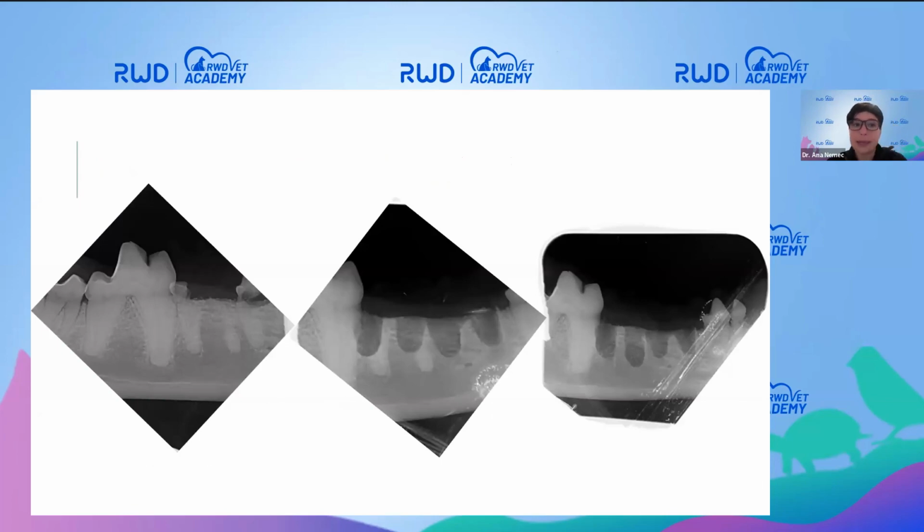This is one of the cases, and probably you've seen that before if you are working quite a bit in veterinary dentistry. You can clearly see that the third and fourth premolars on the mandible are resorbed, and part of the tooth is actually replacement resorption. But then again, we can still see these obvious root tips with pretty clear periodontal ligament, possibly also some periapical periodontal ligament space widening, which can be suggestive of endodontic pathology.